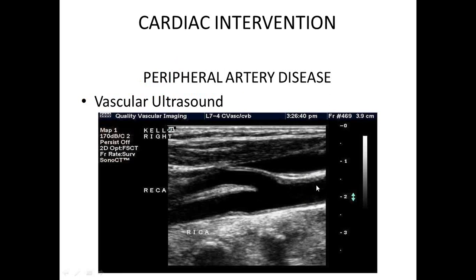So you use your transducer and you go up the neck. So again, the common carotid, and it splits, so you get an internal and an external. Now, it's important for you to know which is which. Just looking at the image will not allow you to identify which one is the internal and which one is the external. And again, these vessels do not come labeled, so you have to determine which is which. And as the lecture progresses, we'll show you how to do that.